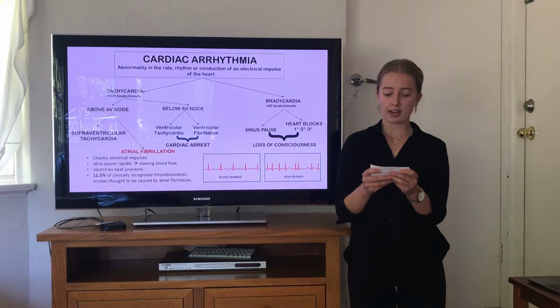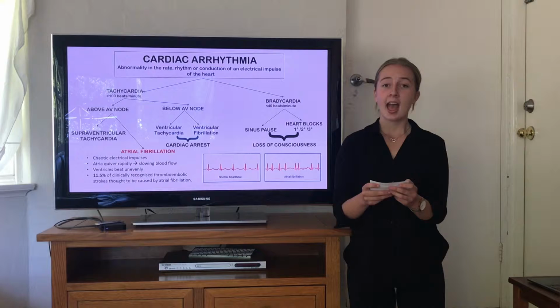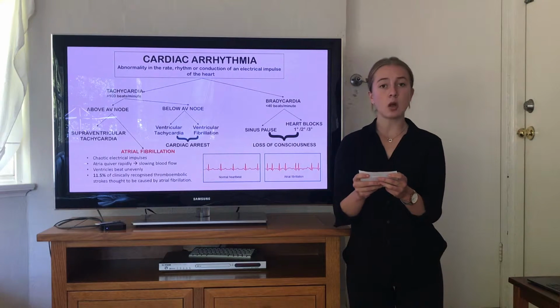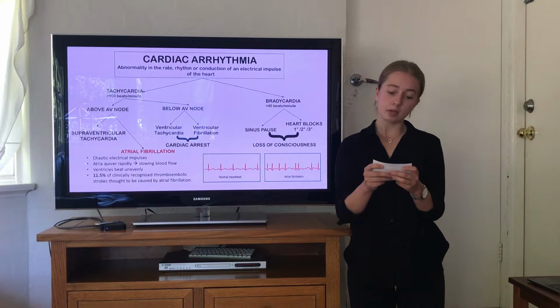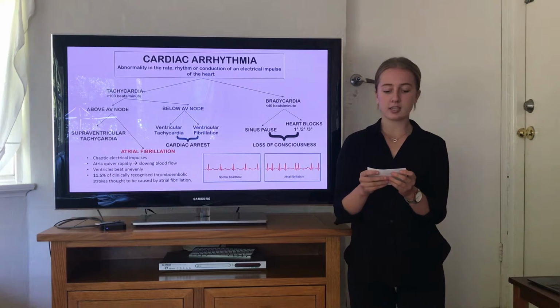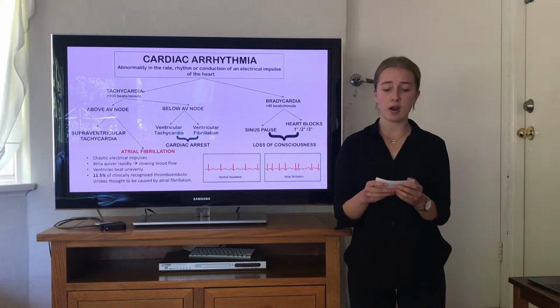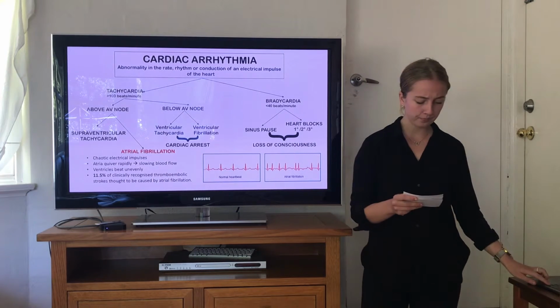An electrocardiogram is the most common form of detection for AF. However, since symptoms of AF are intermittent, with stretches of normal heart rate in between bursts of abnormal heart rate, which is known as paroxysmal AF, it is often very difficult to diagnose. So, how can an app change all of this?